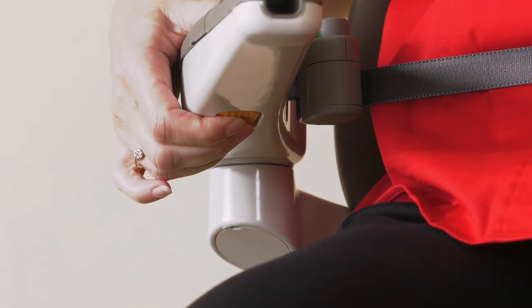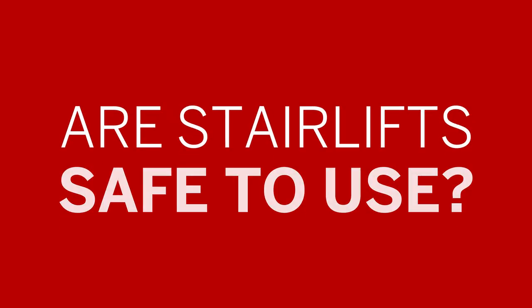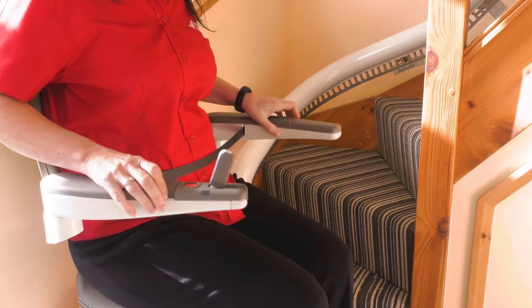Unique to the Flow X is the emergency lowering system button located under the arm which in an emergency will bring you downstairs. Are stair lifts safe to use? Absolutely. All stair lifts have inbuilt safety features as standard. The Flow X comes with a specially designed ergonomic belt that must be worn when in travel due to its interlocked safety system.